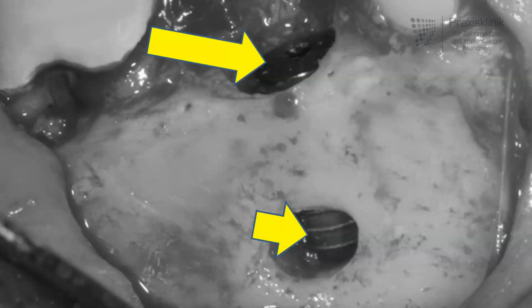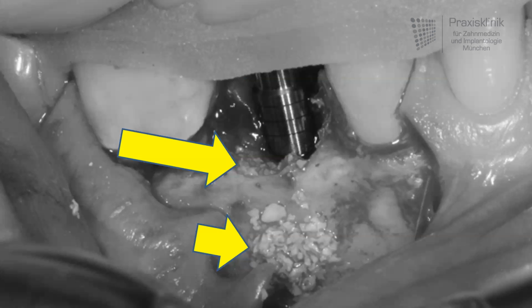It can be the bone which you have harvested from the operation site, or it can be artificial bone deriving from bovine origin or porcine origin, and you have to fill these gaps or these inflammatory deficiencies, which we've done here. And then you just close up the soft tissue again.